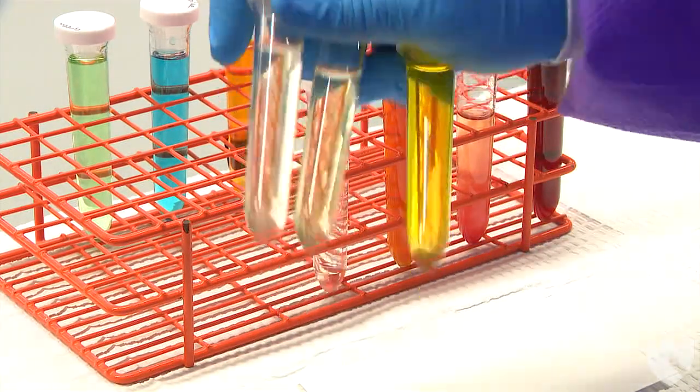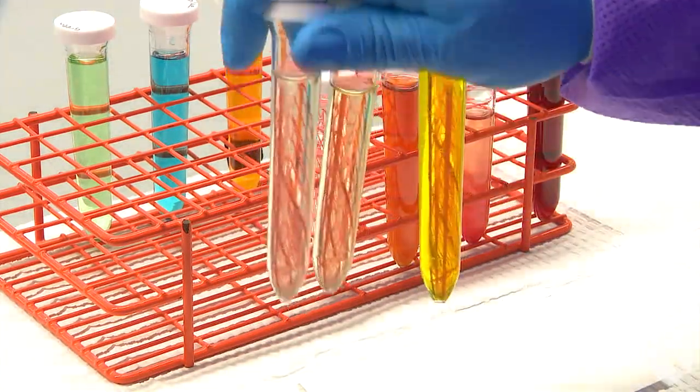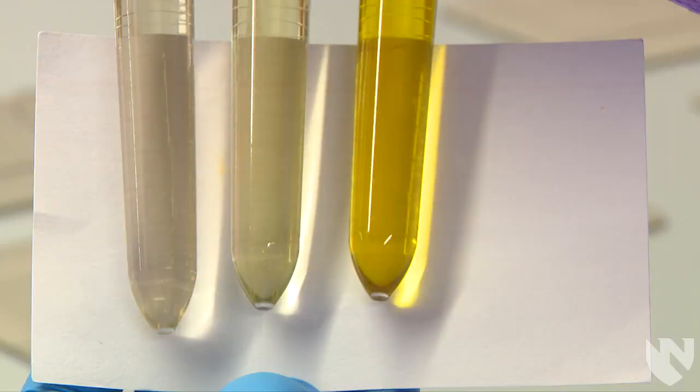To evaluate the urine color, we will hold the urine conical tube against a white background. Here we have a few different variations of yellow. We have a pale yellow, a light yellow, and a darker yellow.